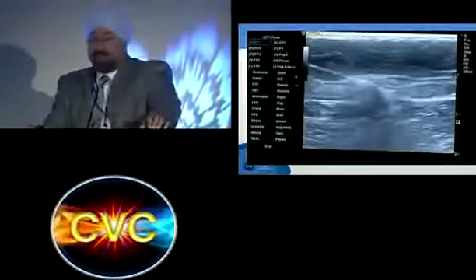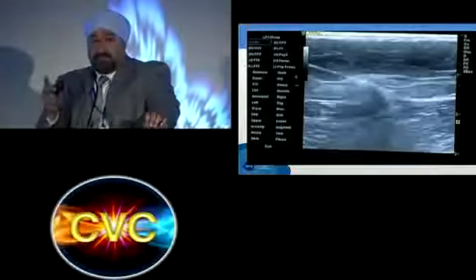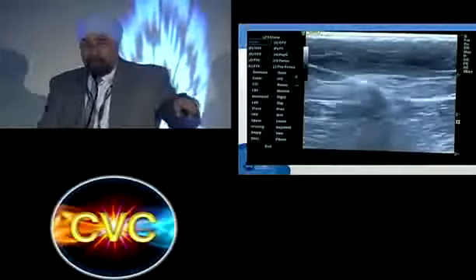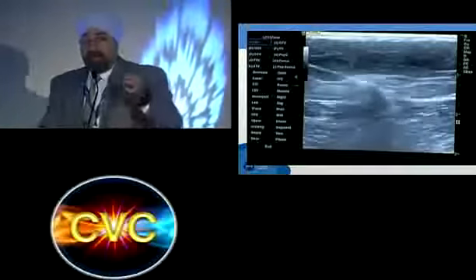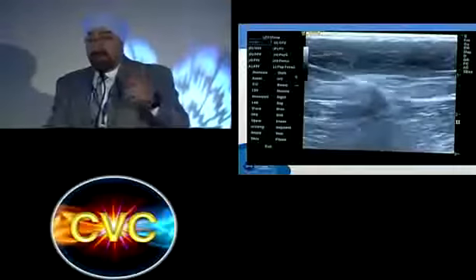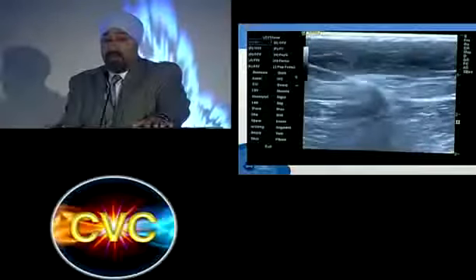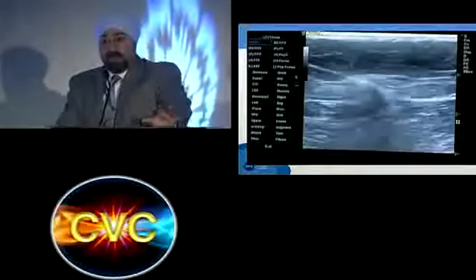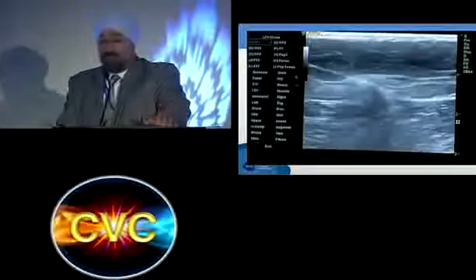Excellent, thank you. So as you can see here, oftentimes one important trick is if you're going to give foam, I kind of look at it as spot welding, so the foam won't go deep in. And then if there's a network, I get that whole network with foam. If you're going to do that, you want to put the butterfly in first, because once you apply the heat, there's spasm, it's very hard to get into it. Oftentimes you may have a network of 2, 3 different perforators in the region. If you're going to do that, sometimes you'll get in the second one, but you may have to stage it because you won't see the second one as well.